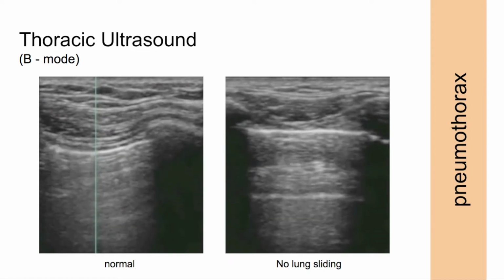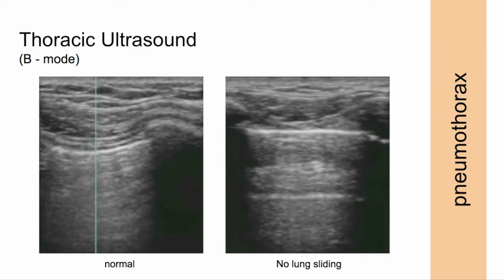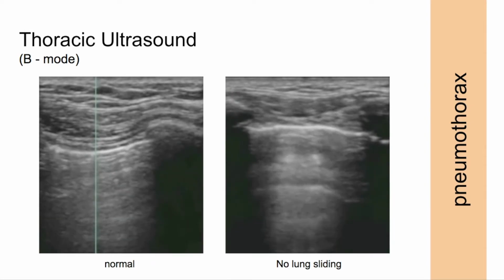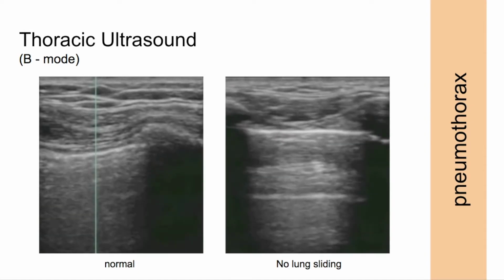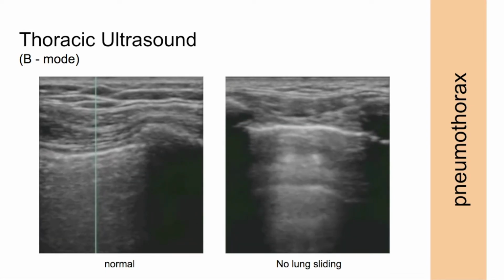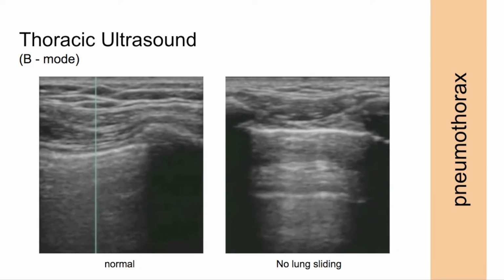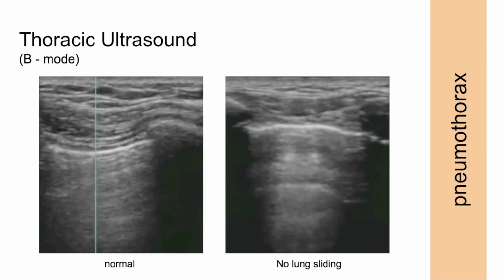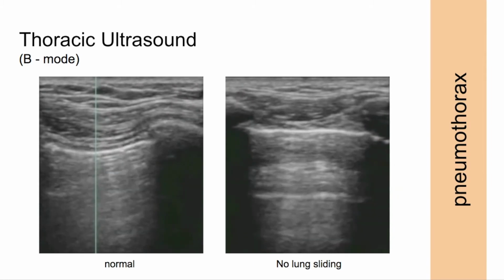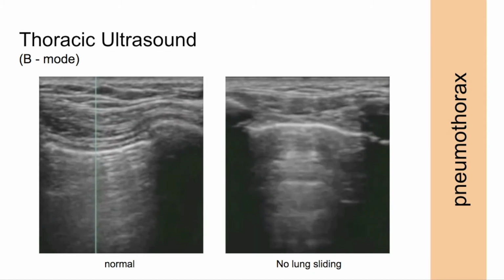The lung pulse is caused by cardiac oscillation and refers to the subtle movements of the visceral pleura in relation to the parietal pleura. In certain concomitant diseases, including diaphragmatic paralysis, prior pleurodesis, or pleural adhesions and emphysema, the sensitivity of ultrasonography for the diagnosis of pneumothorax may be lower. Ultrasonography may be used routinely to screen for post-procedural pneumothorax after transthoracic interventions, as well as after transbronchial biopsy, and may obviate the need for routine post-procedural chest X-ray.